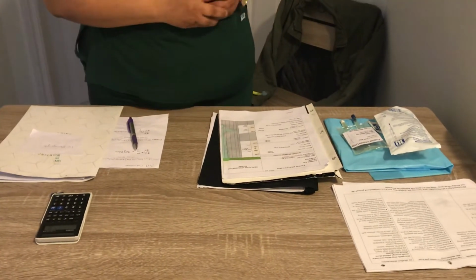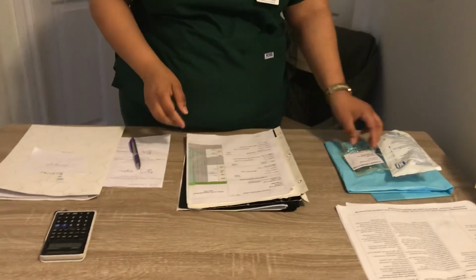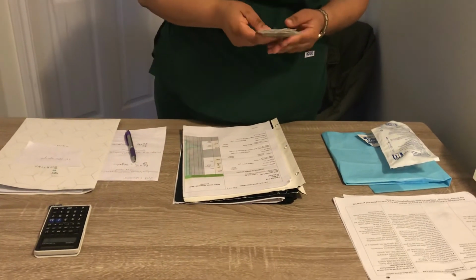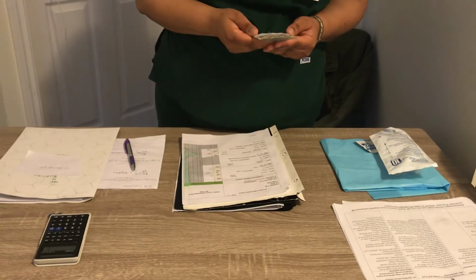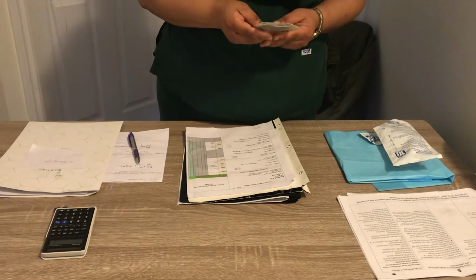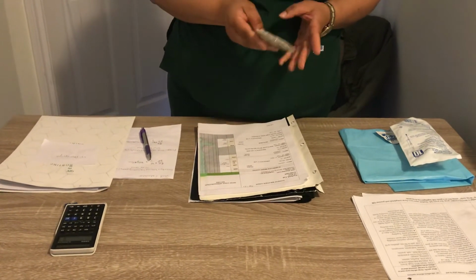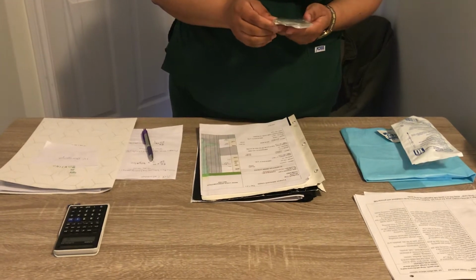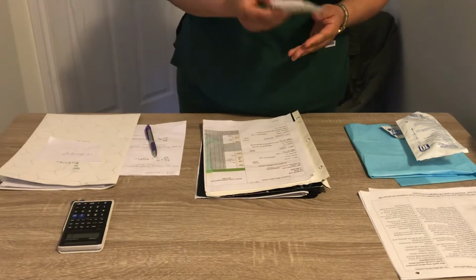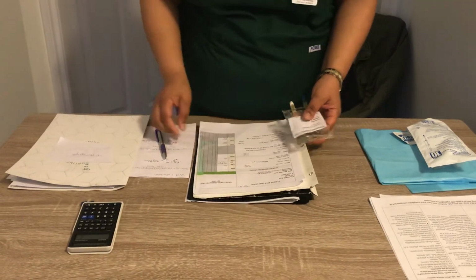So I'm going to come back to the med room. I'm going to perform hand hygiene. And I'm going to check my premixed cefazolin bag. I'm checking for clarity and for leaks. The bag is okay. So the expiry date on the label is December 2020, and the expiry date on the bag itself is November 2020, and that's okay. So now we're going to go to the first check.